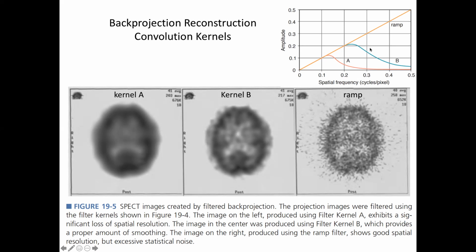You can see with the ramp filter, we get a picture that while you don't lose any information, the picture quality itself is not great because there's a lot of noise, right? And so humans, when they see something like this, they reject it. They don't like it, right? They can't create a filter in their brain to get rid of that noise.